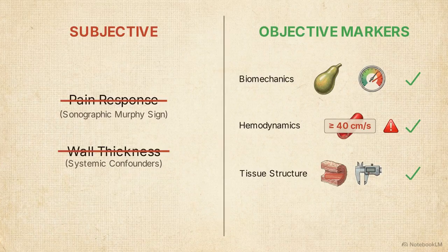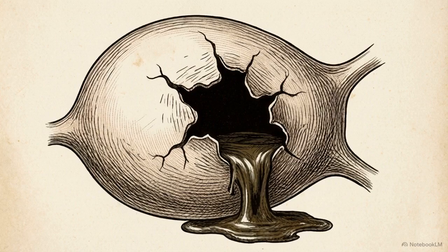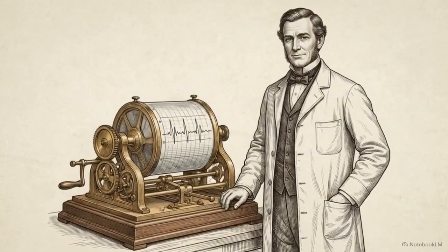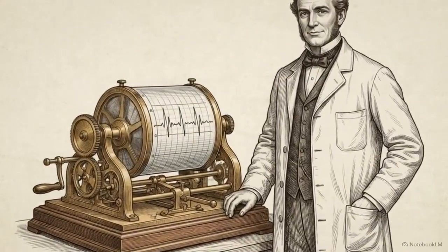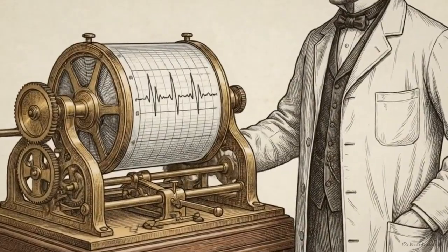And remember, the complete absence of pain or physical distension in a highly symptomatic patient should trigger an immediate search for perforation markers. Integrating quantifiable hemodynamics and biomechanics into your ultrasound protocol provides the objective evidence needed to improve diagnostic confidence and improve patient care.